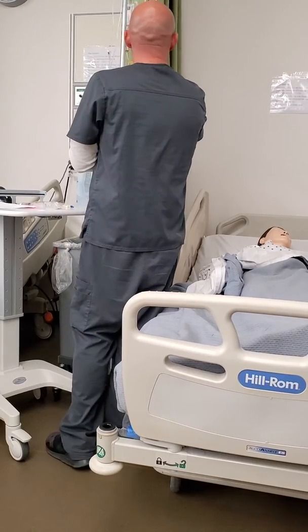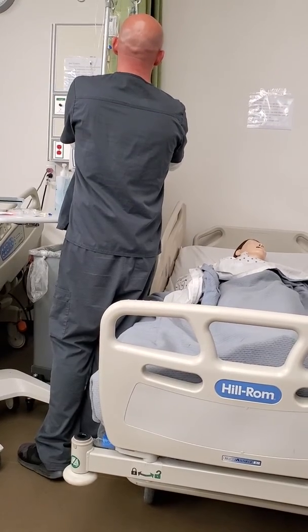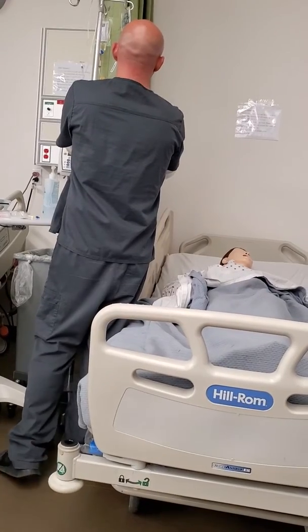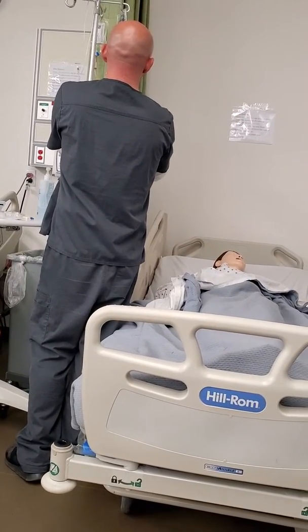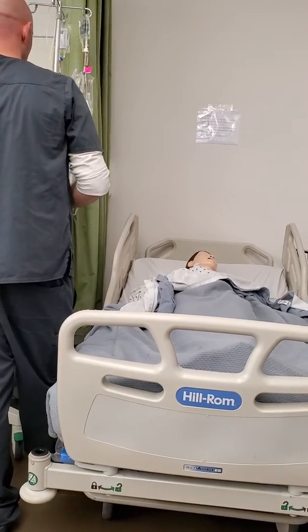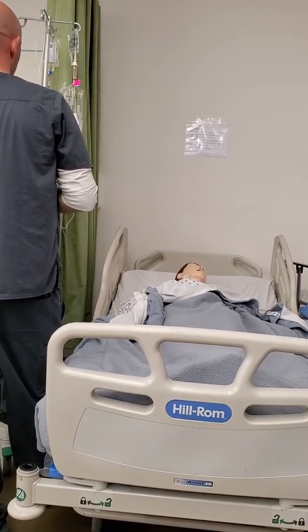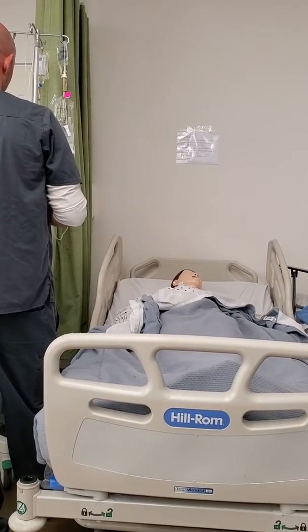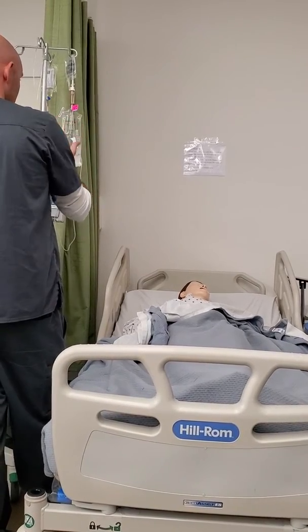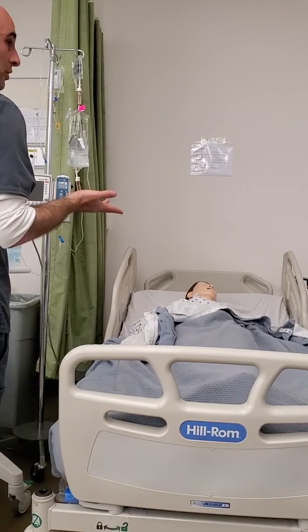I have to check the primary solution, and this was hung 3/7/19. How long's it good for? 24 hours. This is terrible. This is not good. This is well beyond 24 hours. So in this situation, it's been hanging for a week. I would have to get rid of this bag and get another bag of normal saline, which is what I will do.